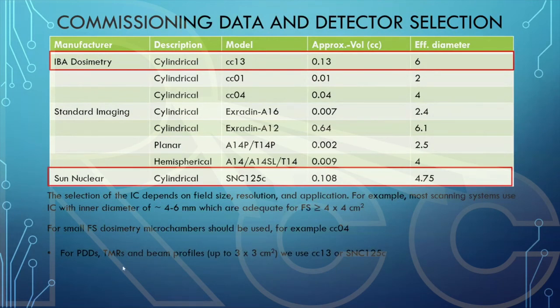In my clinic, we do PDDs, TMRs, and beam profiles down to 3 by 3 square centimeters using the CC13 ion chamber or the SNC125c from Sun Nuclear.